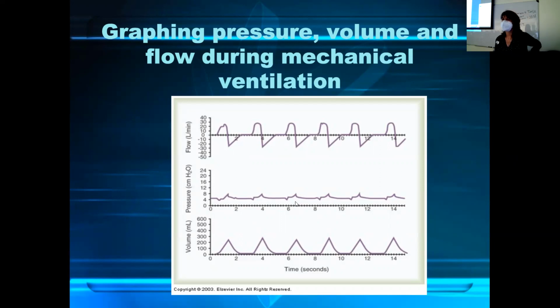Gretchen, go ahead. On the top one for flow, when it's going up is during inspiration, and then it goes down, and then when it starts to go up again, it's when they're exhaling. So what about the drop, what's happening then? The drop is when it's switching from inspiration to exhalation. Yes.